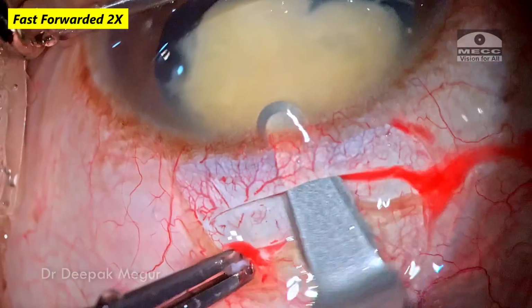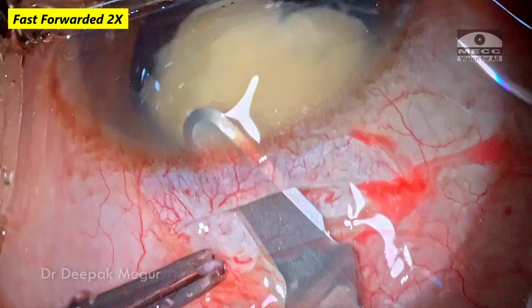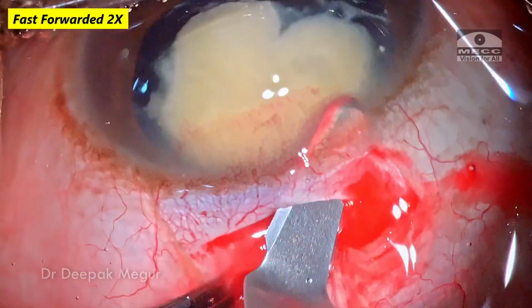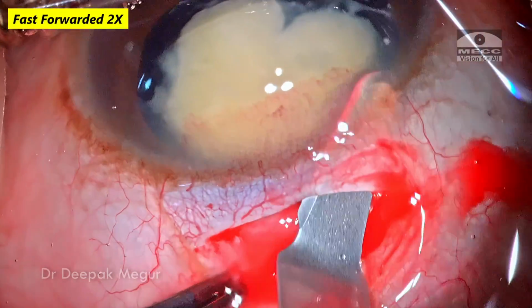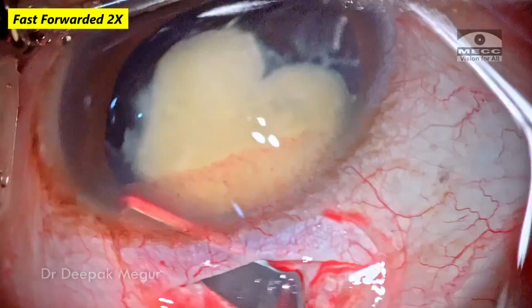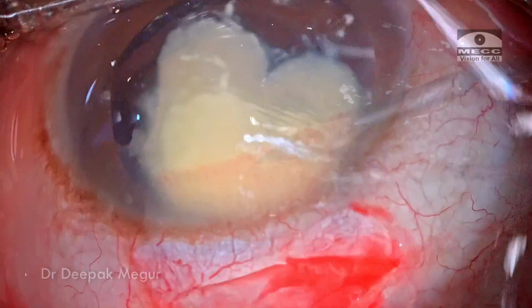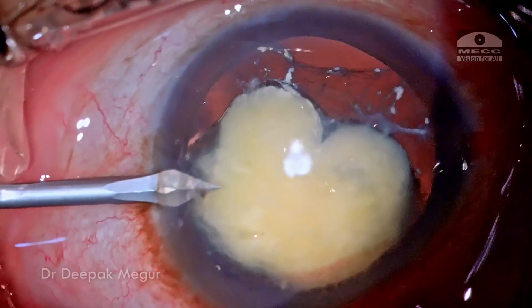Now, since I know that the nucleus is very small, I'm not going to make a very big sclerocorneal tunnel. I've restricted the incision size to about 5.5 millimeters, and this should also suffice for the iris clip lens if at all I need to use it. The side ports are made.